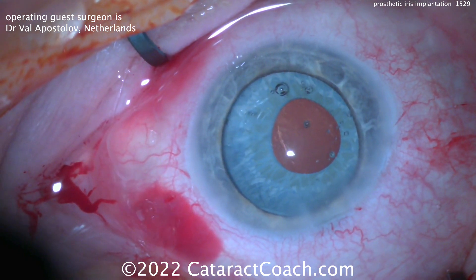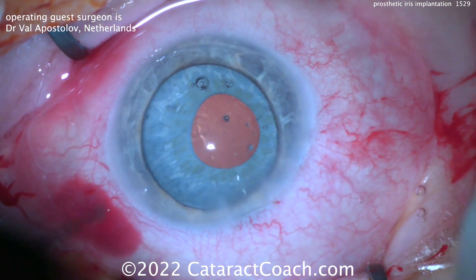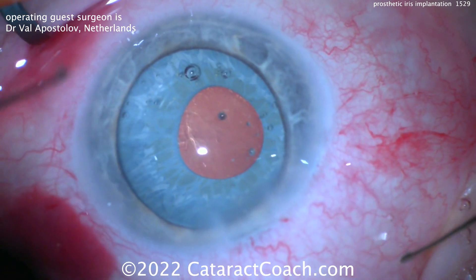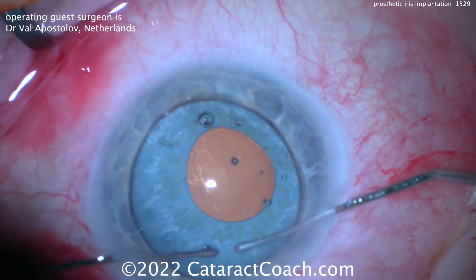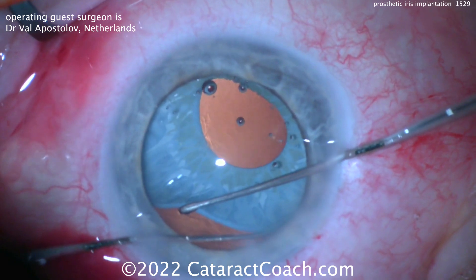You really have to take your time, get this thing in the capsular bag, and then once it is in the bag you can get it centered up and you'll have a pretty nice cosmetic result. If you look at it here, it's not exactly a perfect match, but really at conversation distance it's quite acceptable. And this looks great.